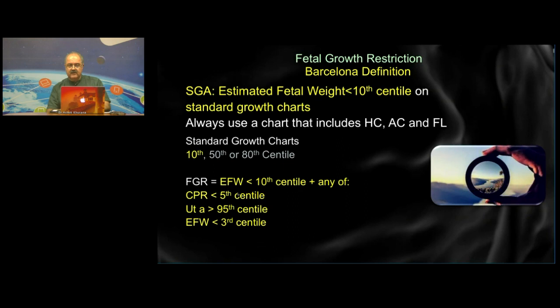We talk now in Doppler in terms of the definition of growth restriction, and we talk about Doppler in terms of the management of growth restriction. And the two are completely different. We will discuss those in the next few minutes. Not in detail, but just to show you how Doppler has made such a difference and how fetal flow has such a decision helping role now in terms of how to diagnose and when to deliver.